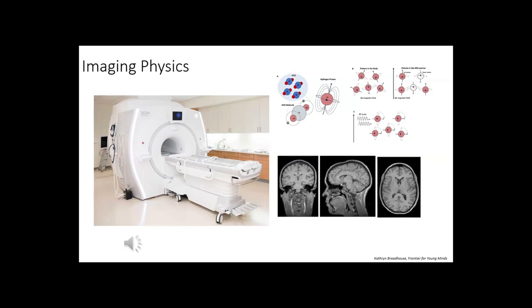This is the fluid connected to your spine. It is very important, because if you hit your head, it helps protect the brain. And because it is fluid, there are a lot of molecules in there, so that is why we see the contrast.